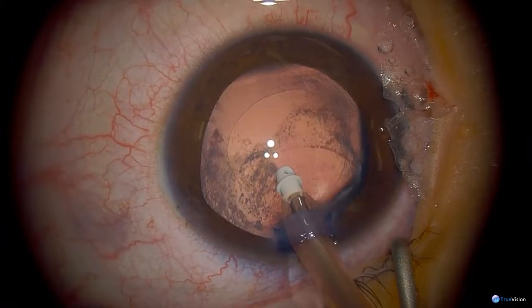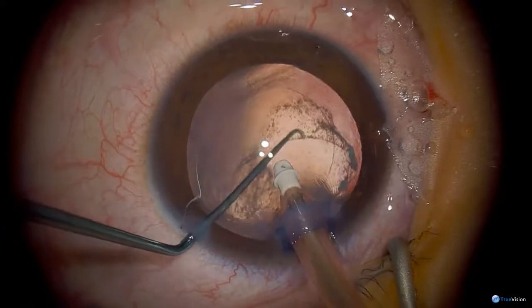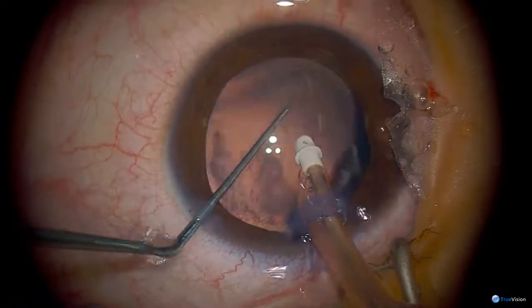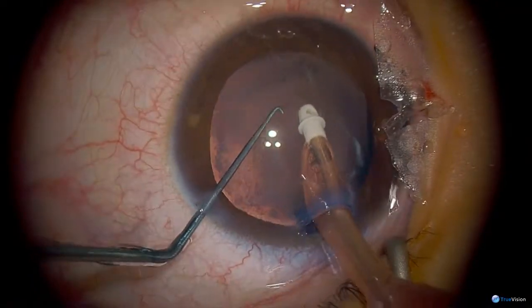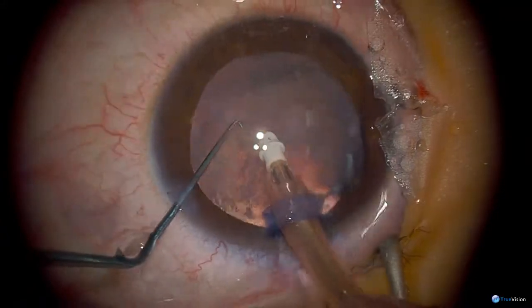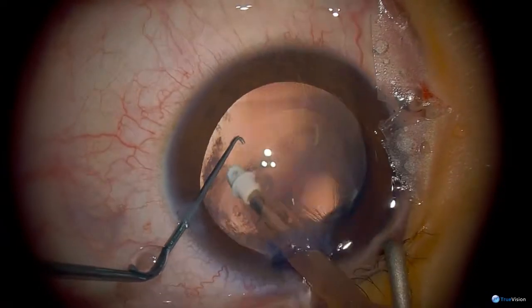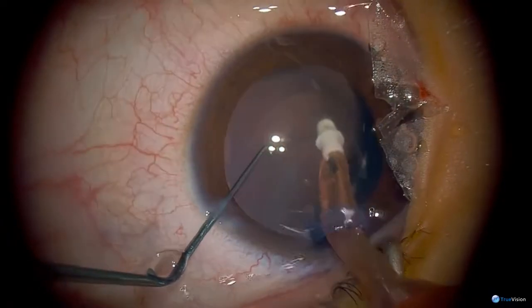It looks to me like he's got some sort of breach in the posterior capsule here. There's a little — it looks like another membrane there. So maybe that's why he's got a cataract. He may have had a breach in the capsule from trauma or something. It's difficult to know what to do with that because I'm not sure if it's part of the posterior capsule or what.